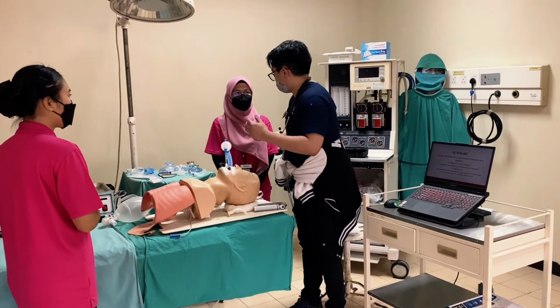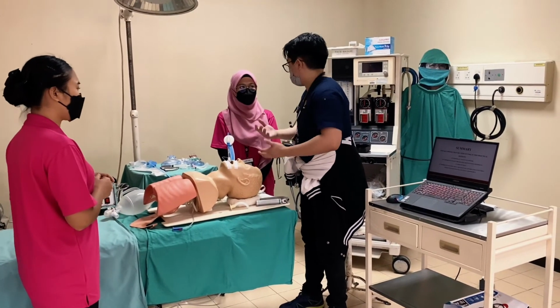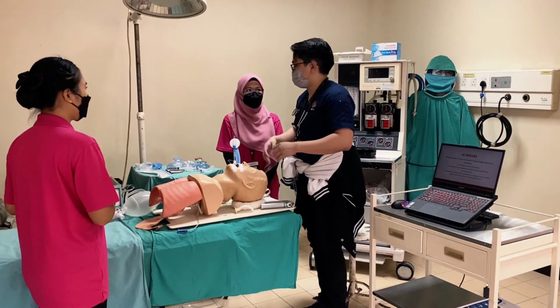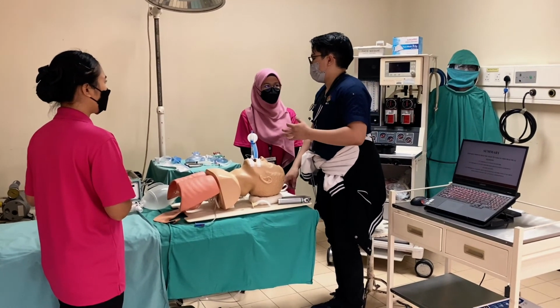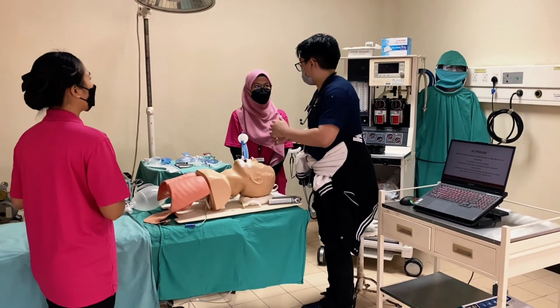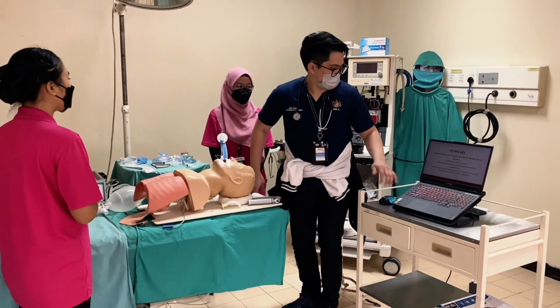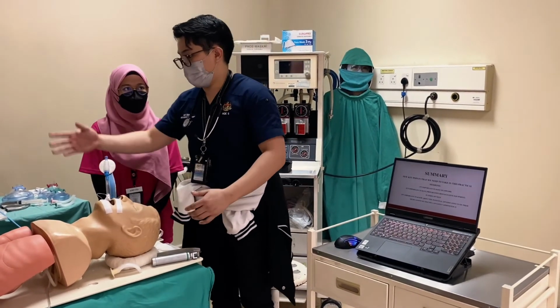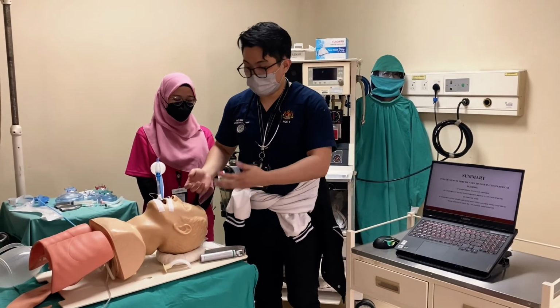Another one, as always, is the team leader. It can be a nurse, a medical assistant, or a doctor. As usual, the doctor will take part in this, but in certain places or departments where there is a lack of doctors, the medical assistant will take part as the team leader. Okay? Then it's important to have preparation, as I said before, of resuscitative equipment. Make sure that we have everything we need for these cases, in times of need.